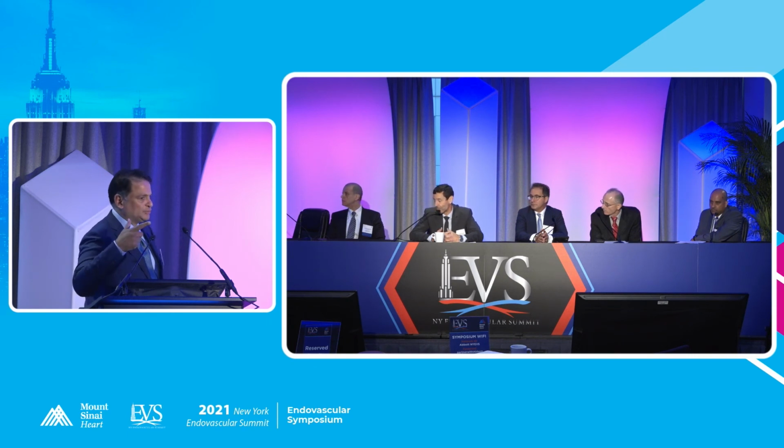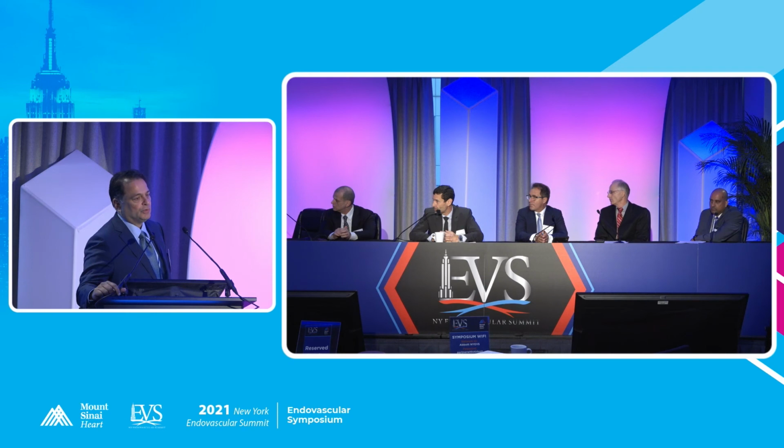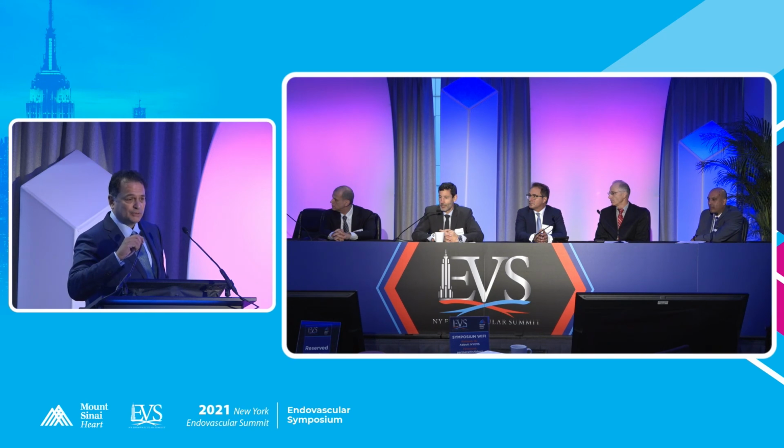I just want to take the Phoenix atherectomy question on. I think that directional atherectomy, Phoenix atherectomy, laser atherectomy, Rotarex, whatever it is that you want to use, it's important for you to understand the devices and see both the strengths and the limitations of all the devices. I think all atherectomy devices are quite effective at what they do. Some may give you a better luminal gain, some may not. Some may have aspiration associated with it. Obviously in our world, very few of us have every toy in the bag.